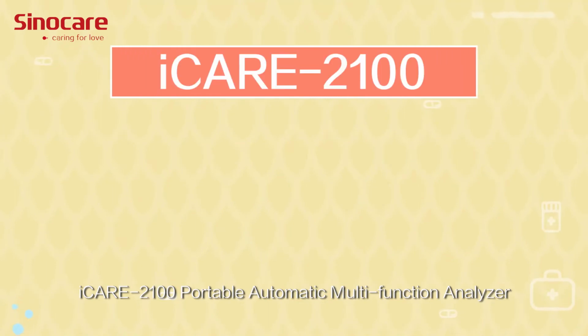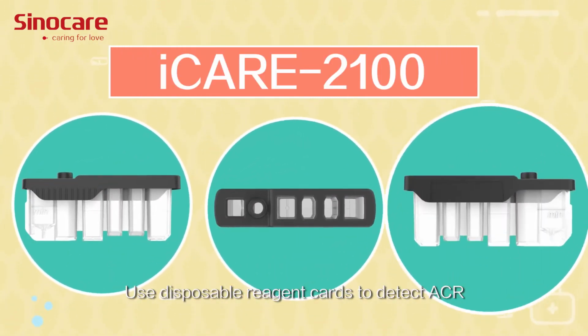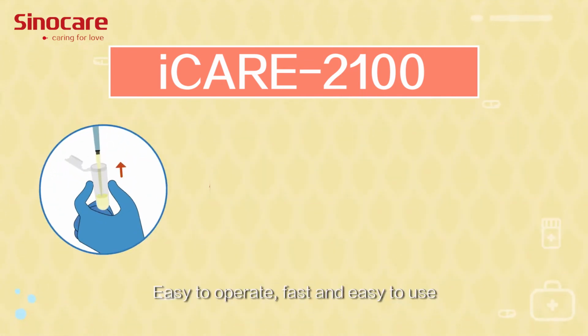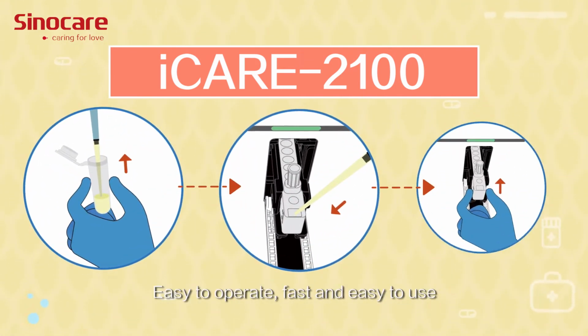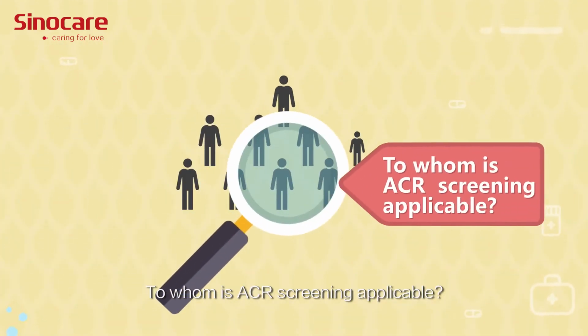iCare 2100 Portable Automatic Multifunction Analyzer. Use disposable reagent cards to detect ACR. Easy to operate, fast, and easy to use. Single serving, no waste. To whom is ACR screening applicable?